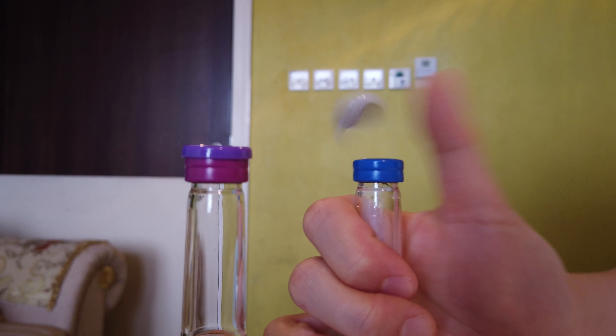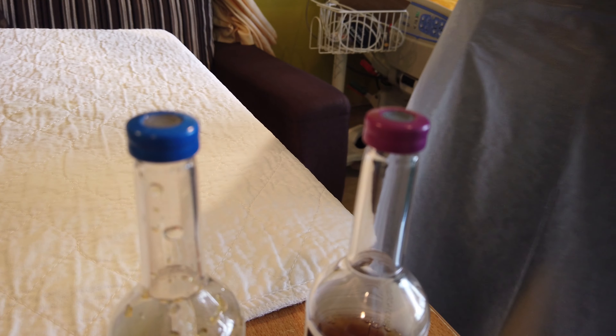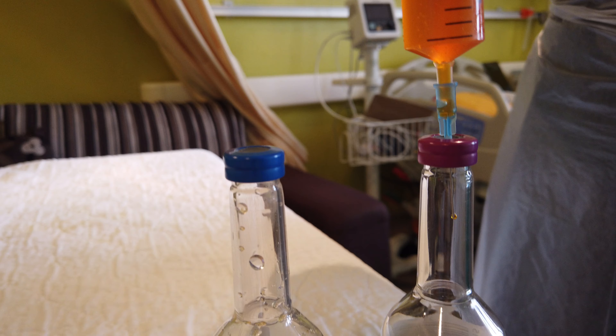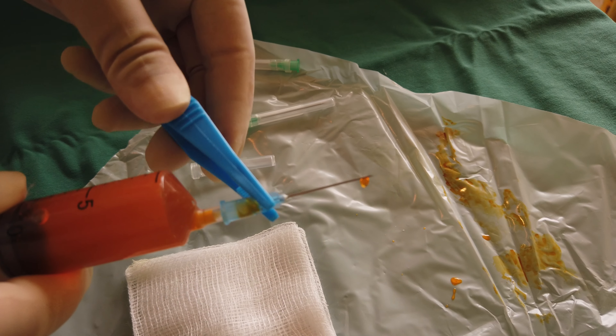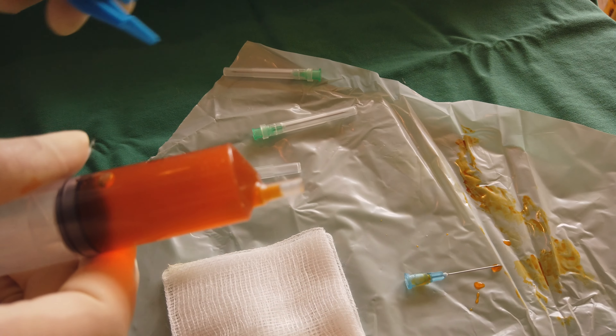Your assistant should now remove the plastic caps of the culture bottles. Clean the top of the bottles with alcohol-soaked cotton swabs. You may then insert the blood-filled syringe into the anaerobic bottle first. Using forceps, remove the existing needle and replace it with a new needle.